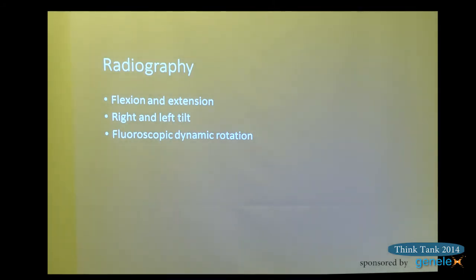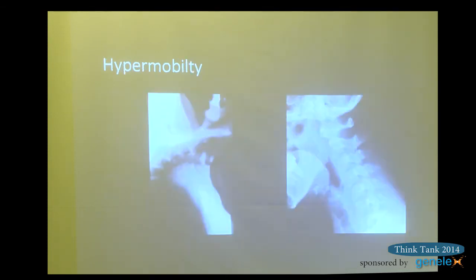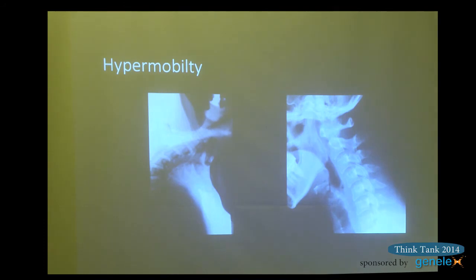We also do radiography in that the open MRs take 4 or 5 minutes per sequence. Some patients can't hold still that long. They're able to push or bend further in the radiography suite for a few seconds than they would be holding for 5 minutes. And this is someone with hypermobility, although they don't bend forward all that far. There's quite a bit of bending back.